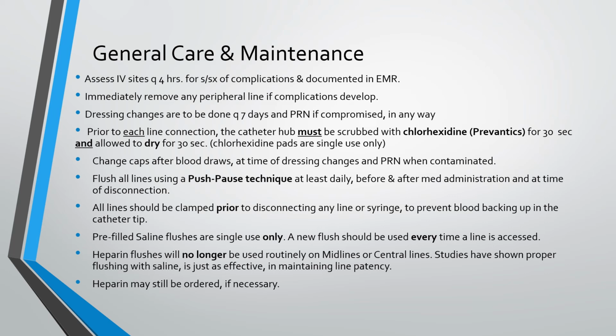Heparin flushes will no longer be used routinely on midlines or central lines. Studies have shown proper flushing with saline is just as effective in maintaining line patency. Heparin may still be ordered if necessary. Portacaths on removal and discharge will require a single-use heparin order.